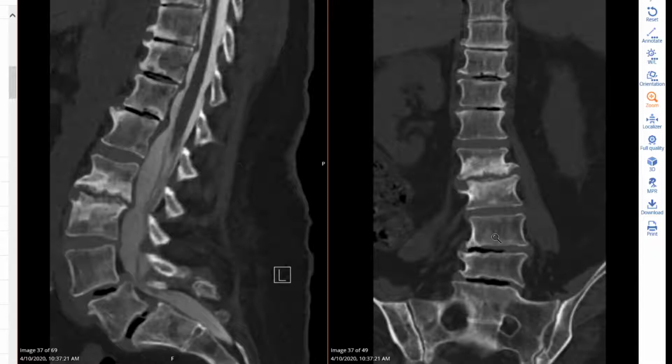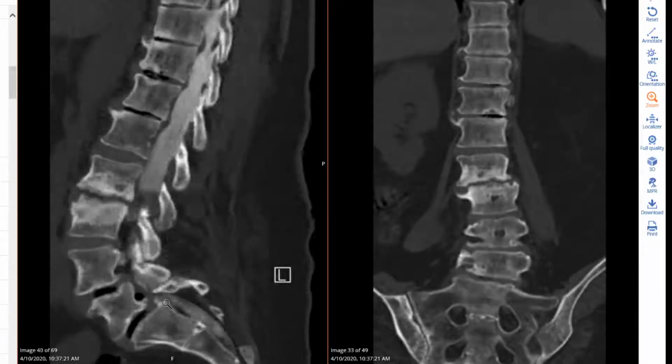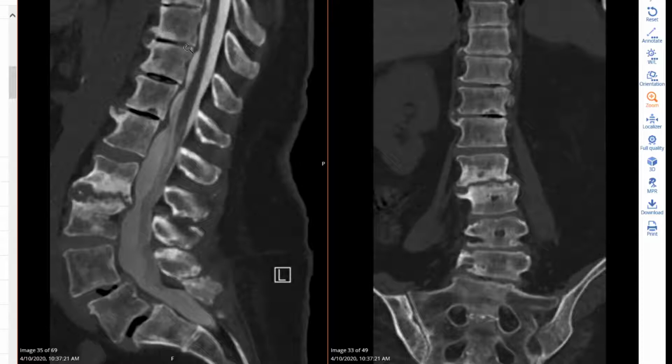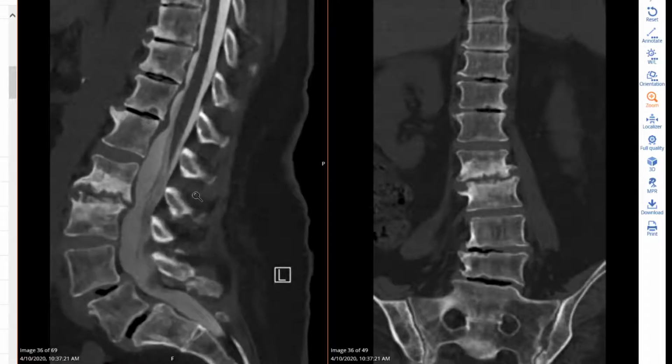And the patient's axial back pain has been treated for years, which has not responded favorably. And practically, we are going to discuss the surgery after conservative therapy has failed. As you see, the patient has in this myelogram significant disc disease and stenosis in the lower lumbar spine, mostly foraminal and lateral recess stenosis. The patient as well has thoracolumbar disease and scoliosis, but clinically that is less pronounced, and the patient is mostly suffering from lower axial back pain and radiculopathy corresponding to L3, 4, 5, and some S1.